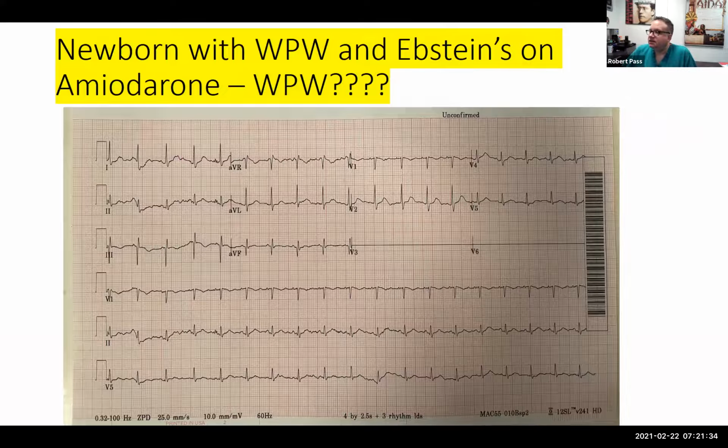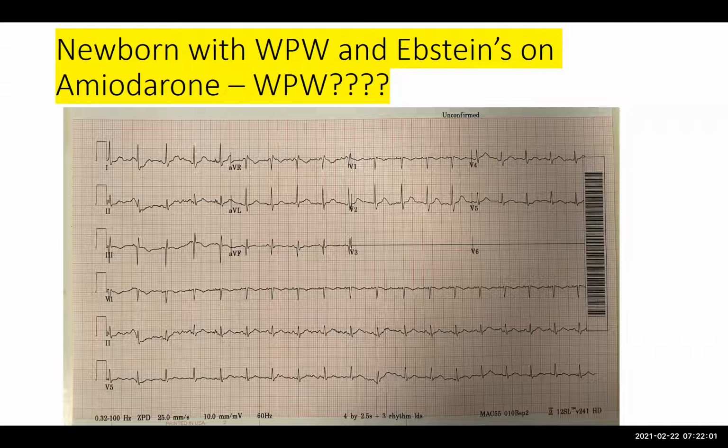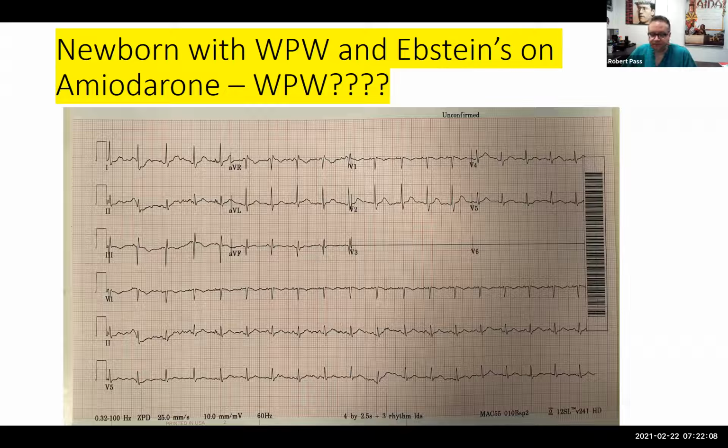All righty. This is a newborn with WPW and Ebstein's anomaly who's being treated with amiodarone, and you're told the patient has a history of WPW, but doesn't obviously look that way. So I'm going to ask Perna Bonsall what she thinks is going on here. Good morning, Dr. Paz. Good morning, Perna. I'm looking at the, give me just one moment. Take your time.